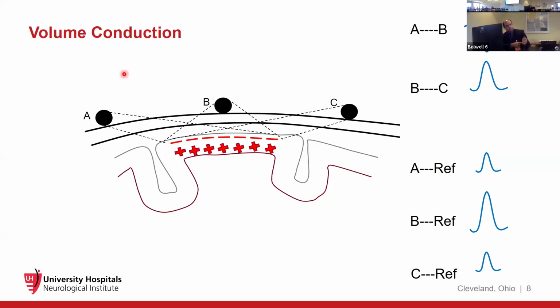You have a limb lead on the left wrist. How does it pick up your QRS? The heart is in the chest. It's not something that's propagating into your arm. It's not a propagating action, but how does it pick it up? It's volume conduction. Because electrical charges and dipoles do not care about anatomical boundaries. They care about if the volume in which you have placed them is a conductive volume or not. And the human body is a conductive volume, okay? So even though the heart is in the chest, obviously, you can record the QRS from the wrist.